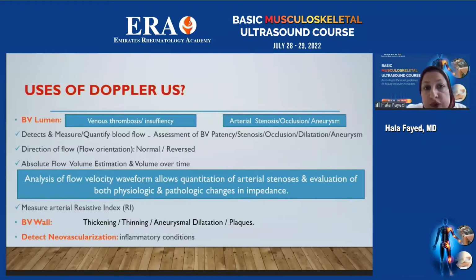What are the uses of Doppler ultrasound collectively? It gives information about the whole vascular system. It shows evidence of venous or arterial thrombosis or stenosis, and arterial occlusion or aneurysm.